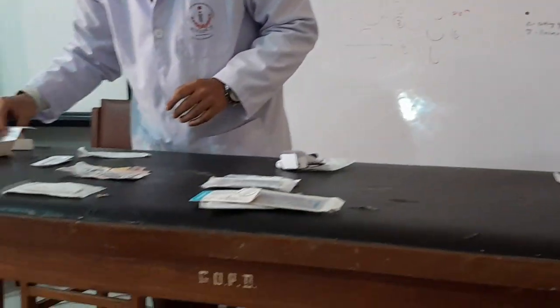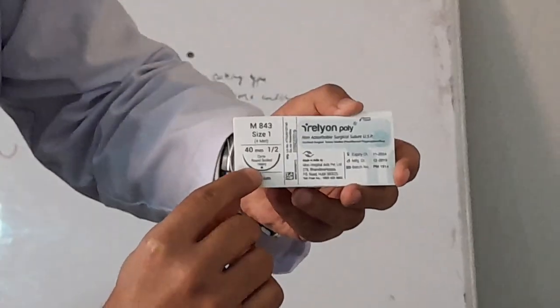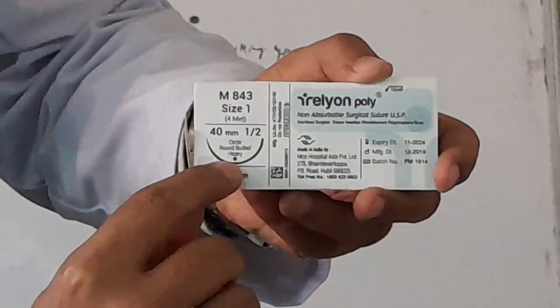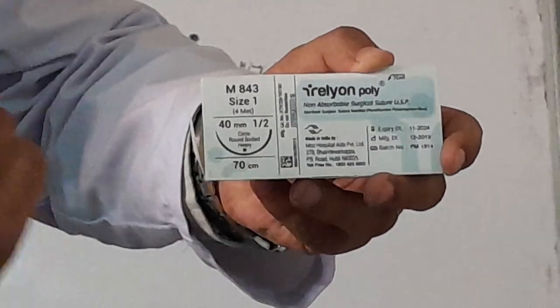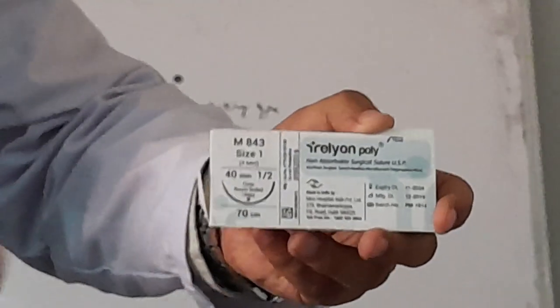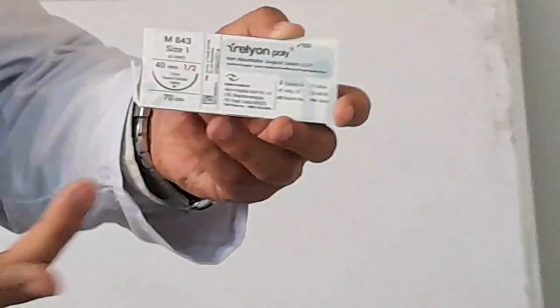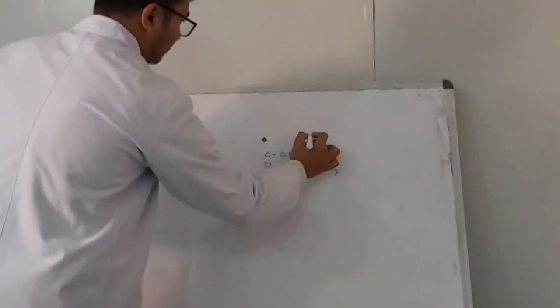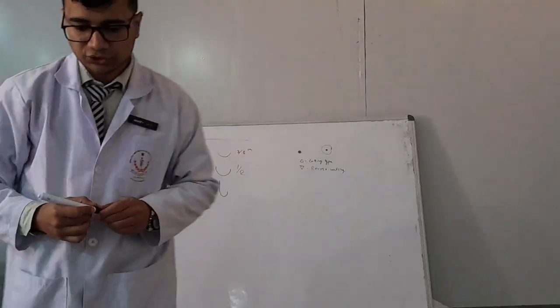Now you can see, I would like to show it here. There is a round dot. You can see the label that is given. From this only you can make out whether it is a round type of body or whether it is triangular in plane or not. Sometimes it can be a fully dotted round structure, or sometimes it can be a circle, like this, and in the middle there can be a black structure.